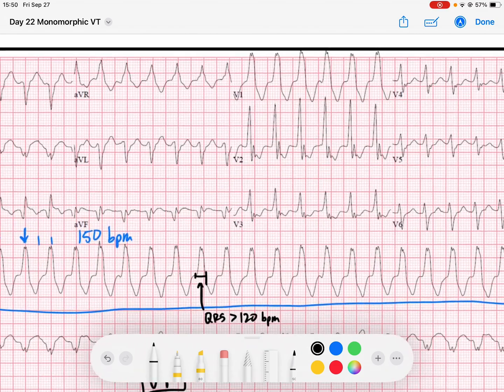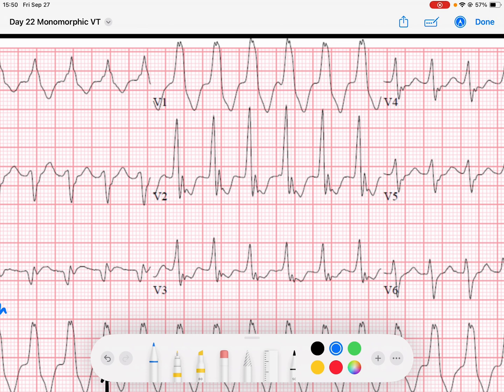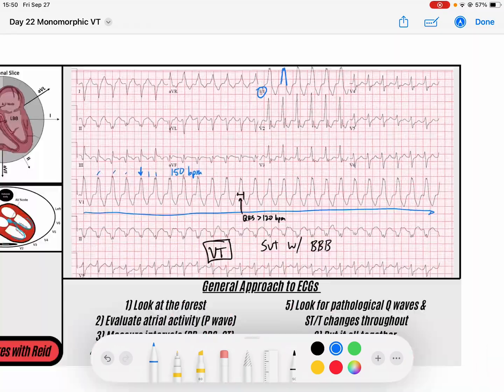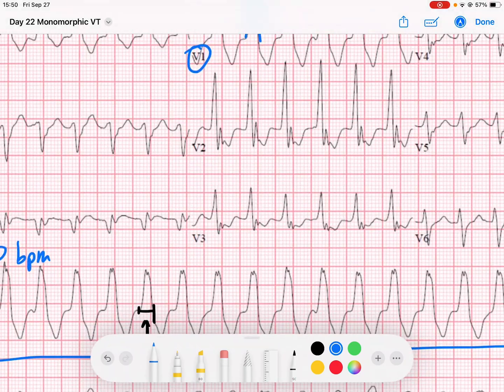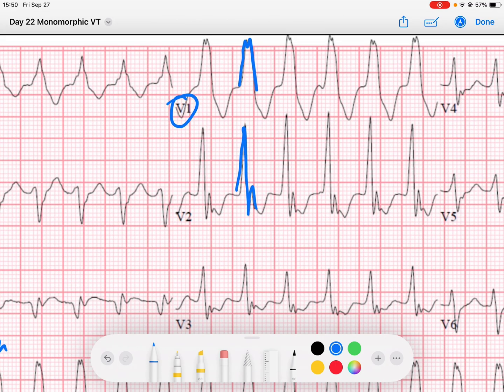Some people, when they look at this rhythm, will look up in V1 and notice kind of this R and then a little bit of an R prime. And in V2, it's got this R, S, R prime. So some might say this is certainly a right bundle branch block — but the answer is obviously no. Let's go through why this is not a right bundle branch block morphology.